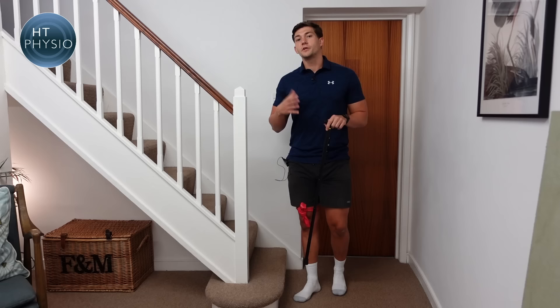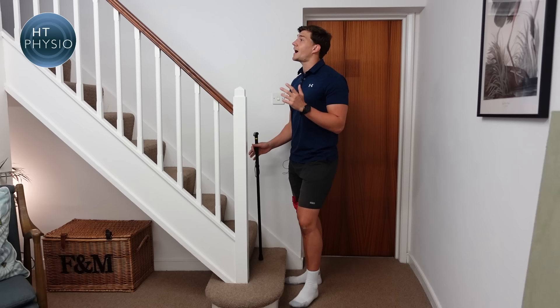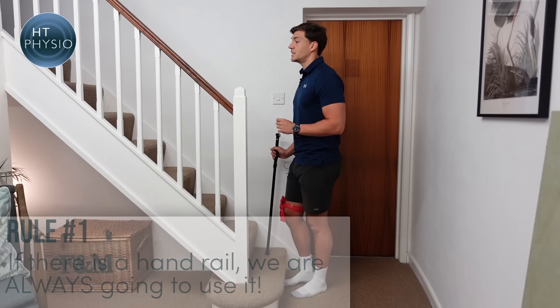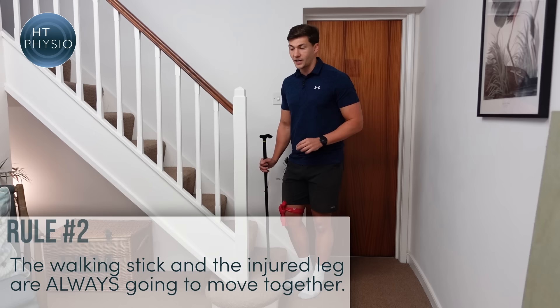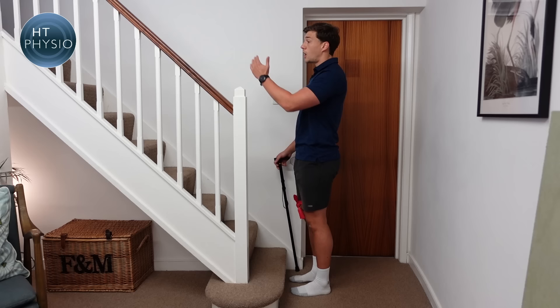I'm going to show you a few different types of stairs — some with a handrail and some without. The first thing we need to do is work out which side the handrail is on. On this staircase, the handrail is on the left side and my injured leg is on the right. There are two key rules: if there's a handrail, we always use it, and your stick goes on the opposite side. The second rule is that your injured leg and the walking stick always move together.